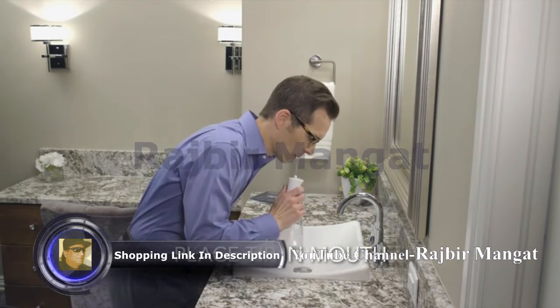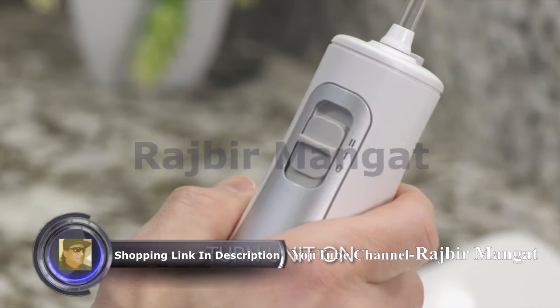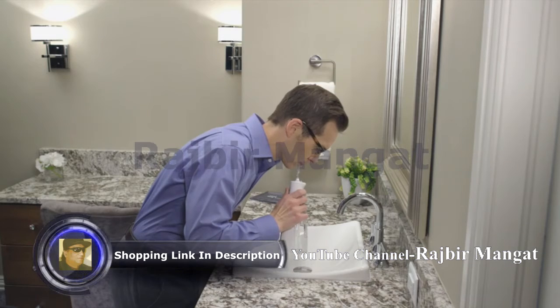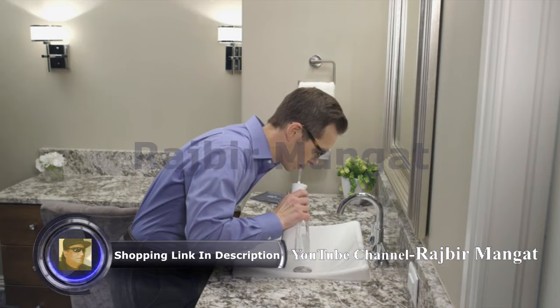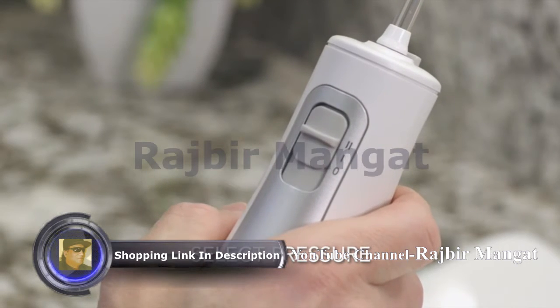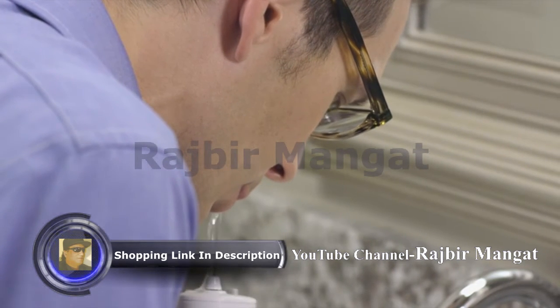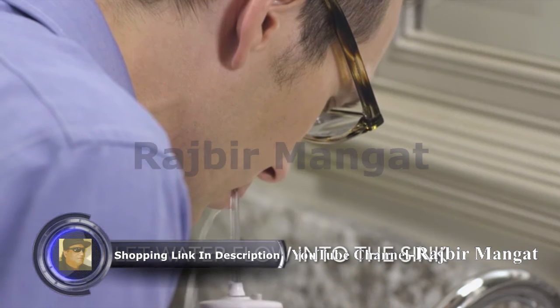To start water flossing, place the tip in your mouth, lean over the sink, and slide the pressure switch to the lowest setting. Turn the pressure to the setting that feels most comfortable to you. The Cordless Freedom has a low and high setting. As you floss, close your lips enough to prevent splashing but still allow water to run freely from your mouth into the sink.